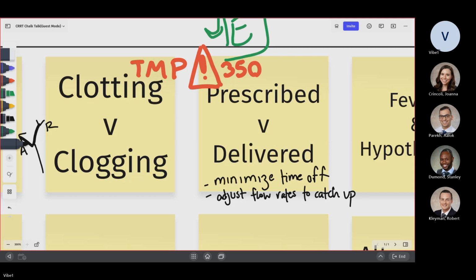But the other thing you have to be careful about is that, at the same time, you don't want to make them hemodynamically unstable. So like you say, okay, the patient is on 25 cc's, let's go for 50. But now if the patient starts to require pressors, at that moment you would like to back off and say, okay, let's just continue 25, let's see. That's why you usually give the nurses a broad range.